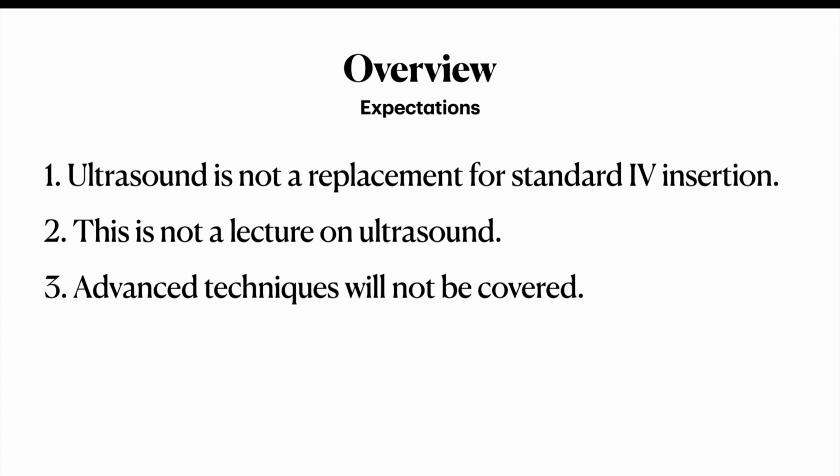With good evidence to support us, it has been shown that the transverse approach is really all you need to obtain an IV utilizing the ultrasound. While techniques such as needle profiling, longitudinal approaches, color Doppler, etc. can be used to help obtain IV access, they are very rarely necessary and will not increase your success rate using the ultrasound nearly as much as understanding the principles in this lecture.